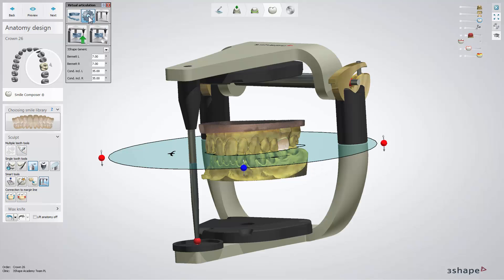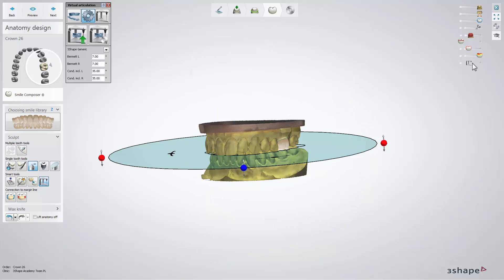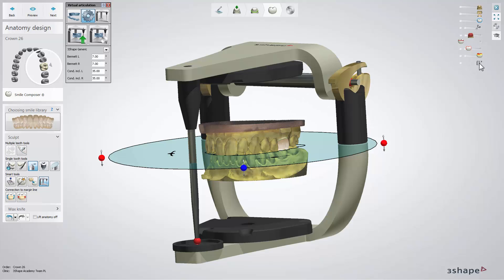Click the Setup button to set the articulator model, parameters, and occlusal plane. Visibility of the articulator can be switched off and on by means of a slider.